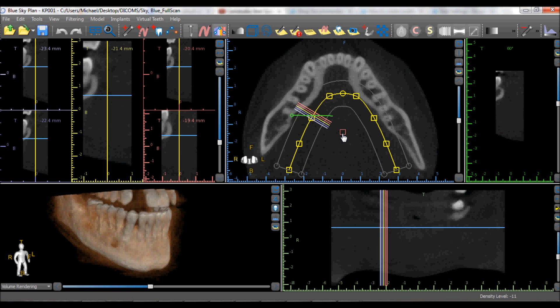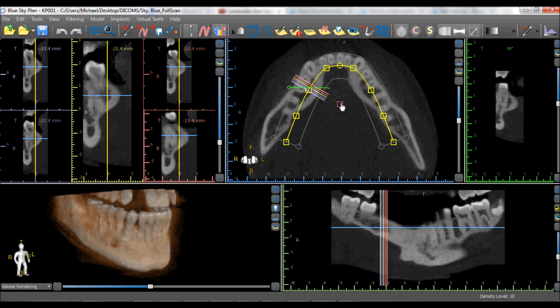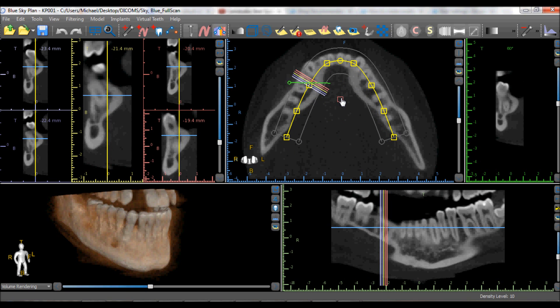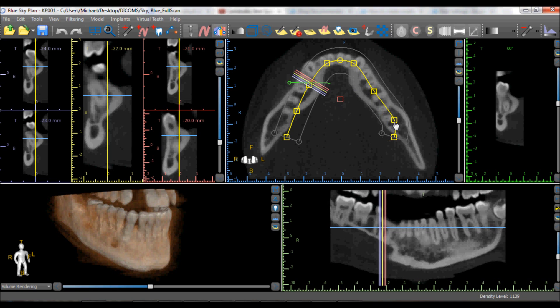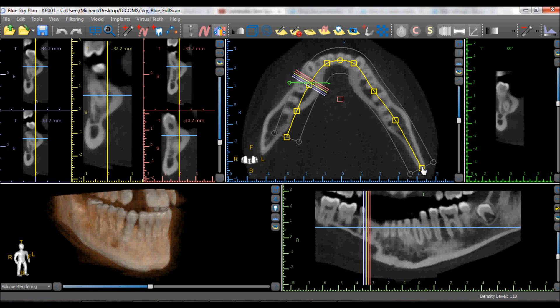The square in the middle of the panoramic curve can be grabbed and dragged to move the curve in its entirety. Any of the squares along the panoramic curve can be grabbed and dragged to align and position the panoramic curve as desired.